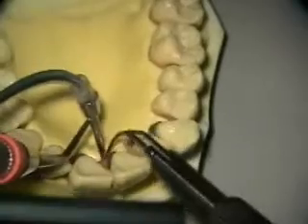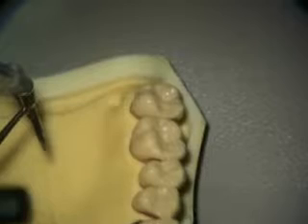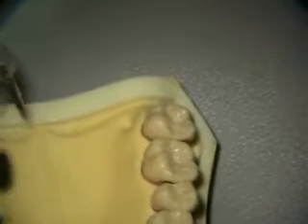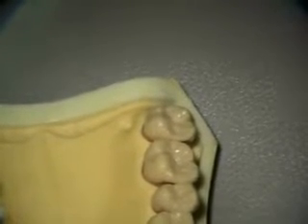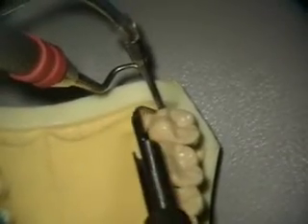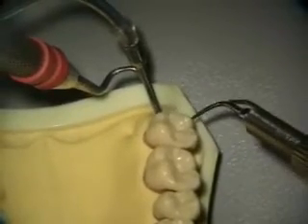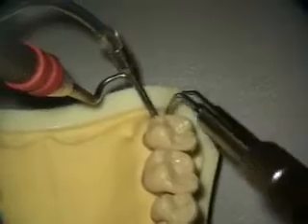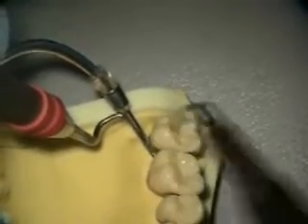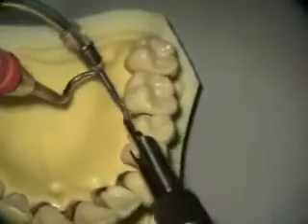If there are some areas you want to recheck, you can do that. Then we're going to reposition and go with the right-right, going to the distal of the molars, working in this way or working in from the cross side. Going to the distal, cleaning, sometimes cross-instrumenting, going to the distal here.